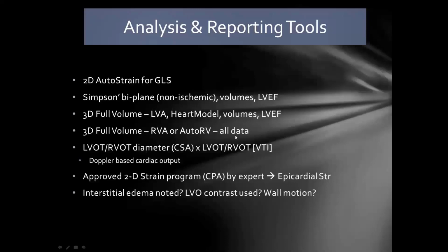3D, the same thing. If you don't have the program to run anything in RV, the only thing I would say is that if you have a 3D volume and you have a multi-plane program, you could still look at the RV function in multiple planes. So it's still not a bad thing to have, even if you don't have the quantitative software. If you choose to do it and you want to get isolated cardiac outputs, you can put that in your report. I like doing it because it's very fast, but again, this will be based on your protocol at your hospital.